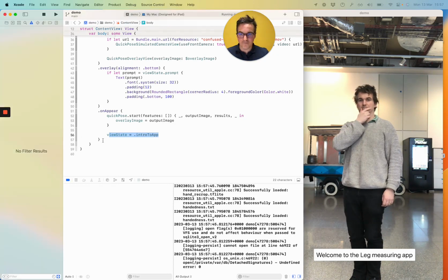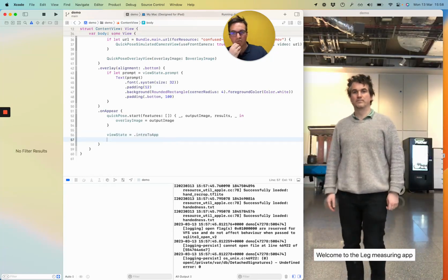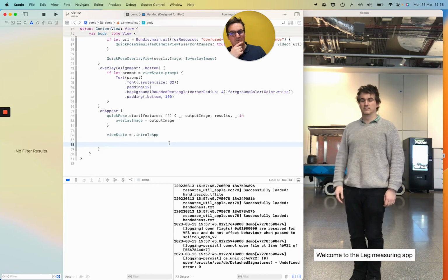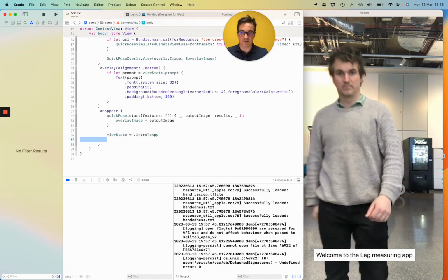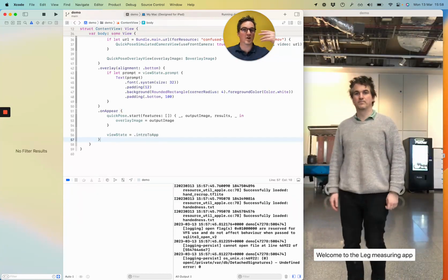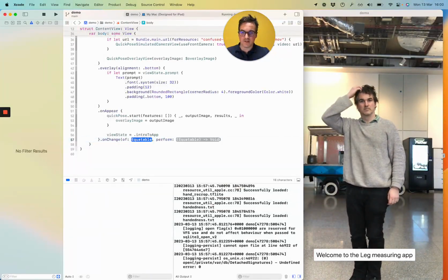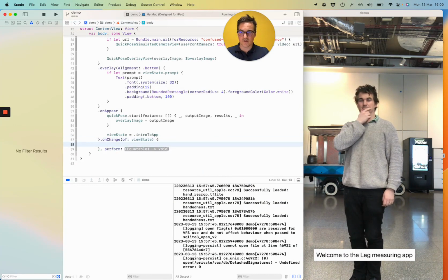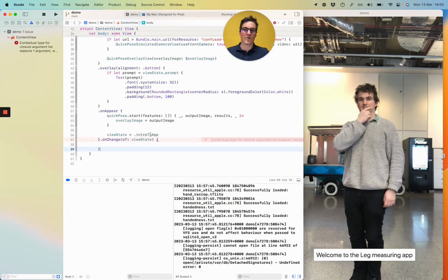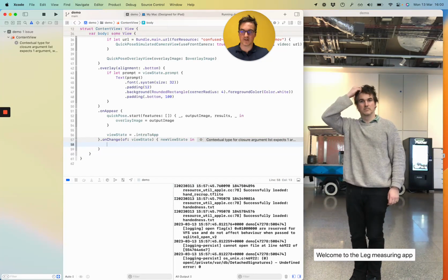What I'm going to do is put that transition in now. There's two ways which come to mind. One is using a delay function here to say, okay, we'll show that for 2 seconds and then we'll go into the intro to measurement. But I want to do a slightly more robust method, which you'll see we can use over and over again. So we're going to use an onChange function here, where it takes the view state and then performs a function with the new view state. So that means whenever we change this state, we'll be able to get a new value. And we'll just bring it out as new view state down here.